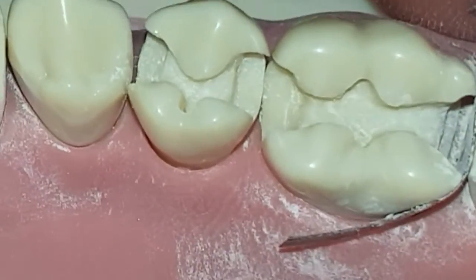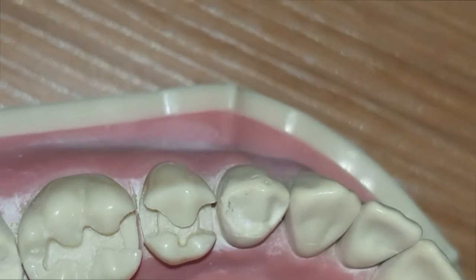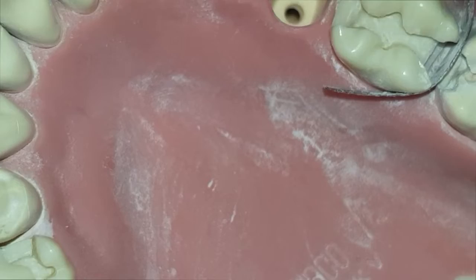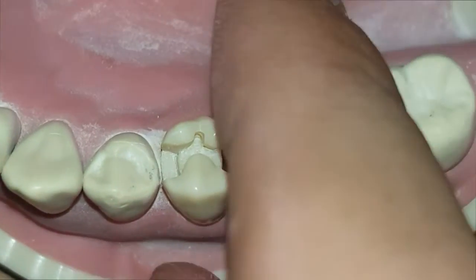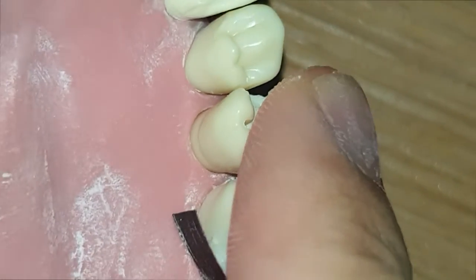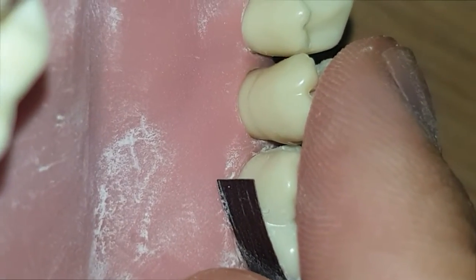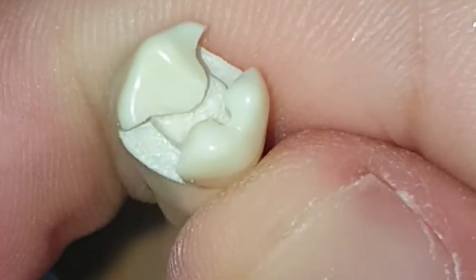This is my preparation. But, you know, the most scary thing is that I prepped the tooth thinking that it is tooth number 29, but the fact is that it is tooth number 20. I was thinking why it has a super-erupted tooth. Though I push it down — you can see the enamel CEJ — the cemento-enamel junction is above the gingiva. I'm a man full of mistakes, but I will do my best.